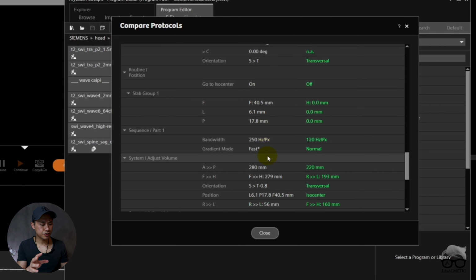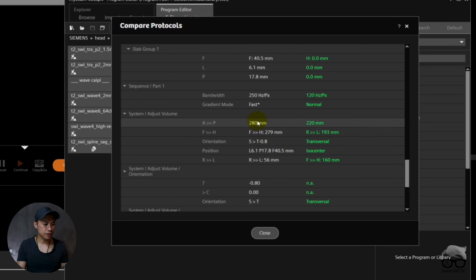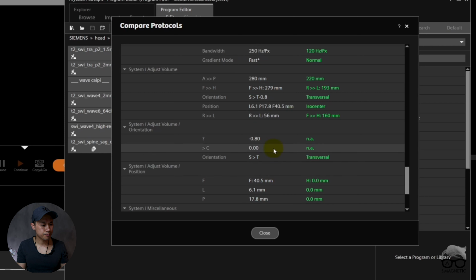So you can see here the bandwidth is also changed and the gradient mode. Yeah, there's a little bit of change here and there compared to the original one, just to cope with the spine.